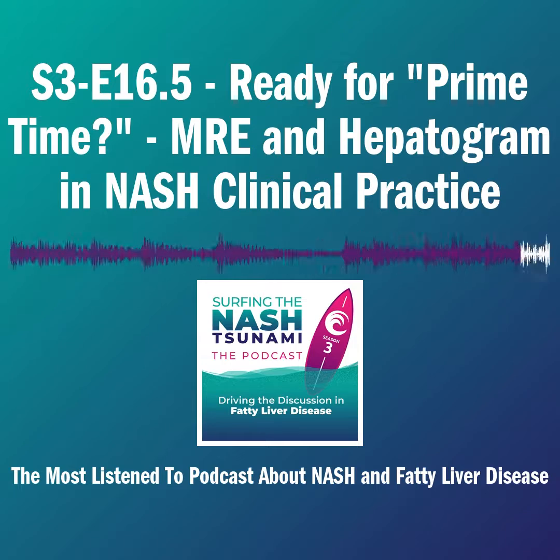It's a research study I've certainly always wanted to do, but it's one of those things that's too many projects, not enough time. But I don't know if you've seen the MRE images, but if you have a red liver, it hits you. Red is bad. I've always heard you say if they can see the movement in the FibroScan values, they feel like their weight loss meant something. Showing them your liver went from, well, probably not red to green, but from green to purple, that would be impactful. I agree with you completely. It's something we should look at.